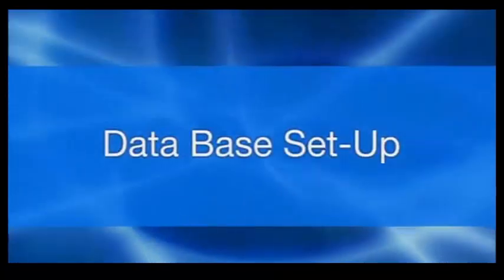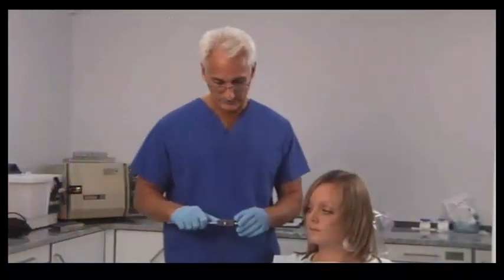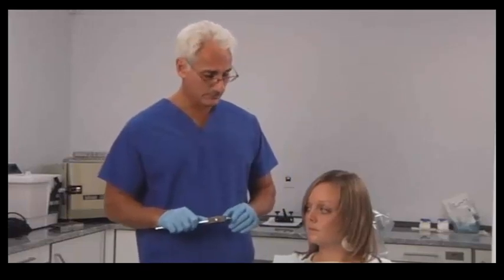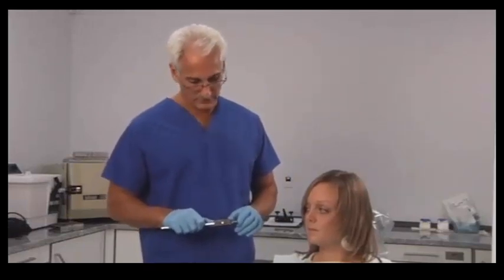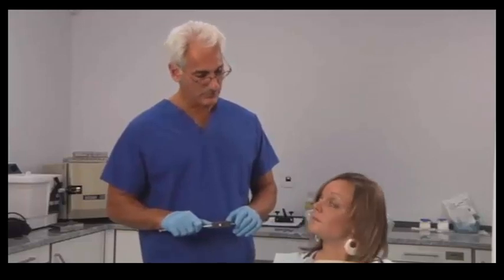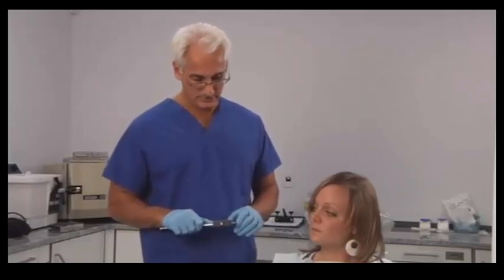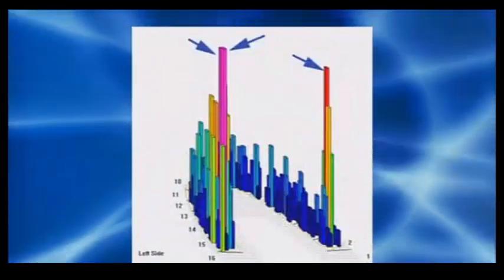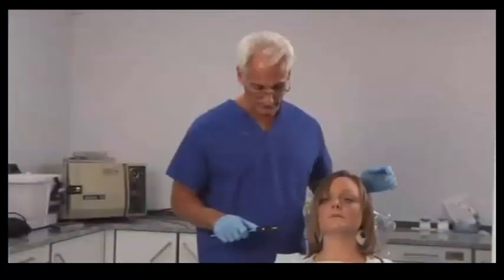So the first thing we have to do is set up a proper dental arch for you, and that involves measuring your central incisor width, which we'll do with this digital caliper. And then we'll choose a proper recording sensitivity for your bite strength, which allows us to record accurate force information. And to do that, we like to have only a few, 3 or 4, red or pink cells on the sensor. Okay, so put your head back for me.